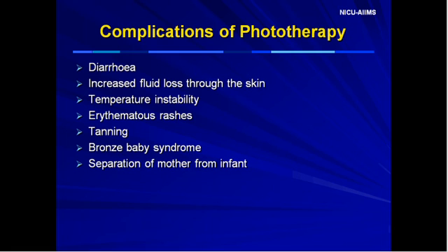Exposure to phototherapy lights produces damage to the retina. Phototherapy increases skin blood flow through a mechanism known as photorelaxation, the pathway of which is believed to involve the production and action of nitric oxide on the vasculature of the skin. However, endogenous carbon monoxide production has also been associated with vasorelaxation.